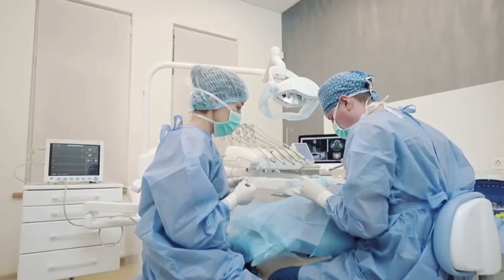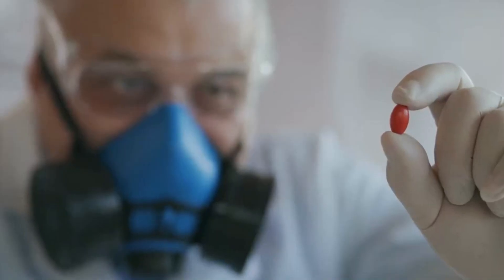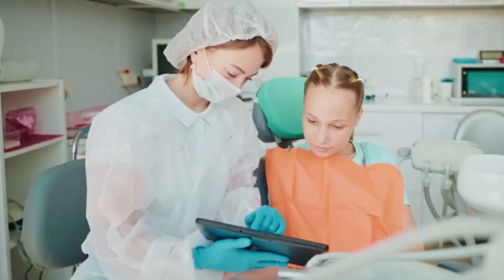If you don't touch bone, you need to relocate. I withdraw the needle and swing the barrel further back into the patient's mouth so the needle itself moves forward. If you think you touched bone too soon, withdraw and move the barrel of the syringe more medially, then re-inject to contact bone a little bit later. I always stress to the patient that for this to work, they're going to feel their lip go fat — the numbness will affect their lip and their tongue as well.